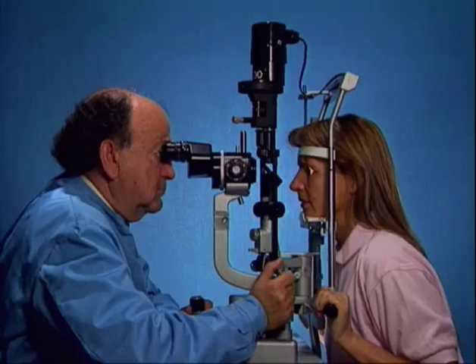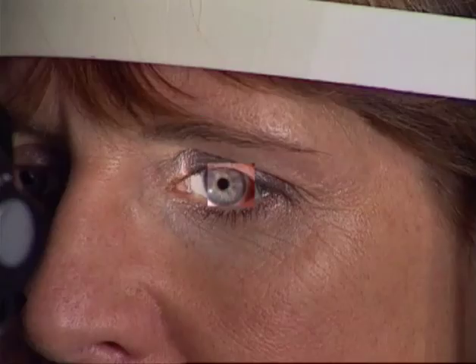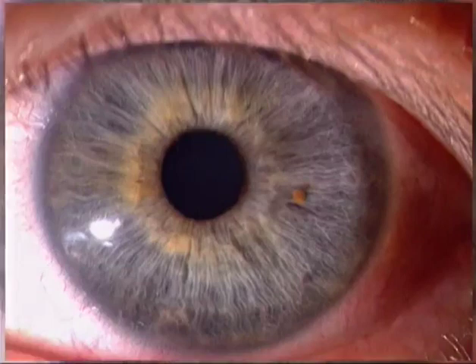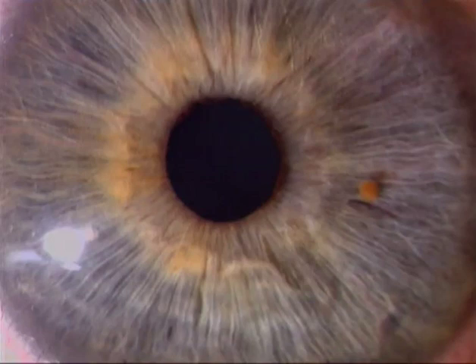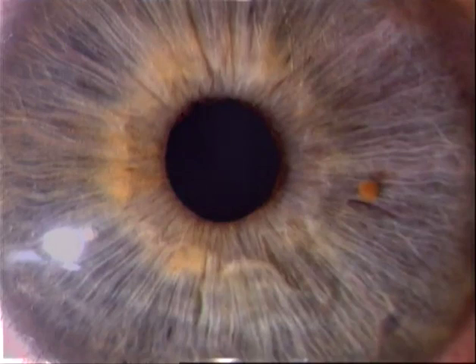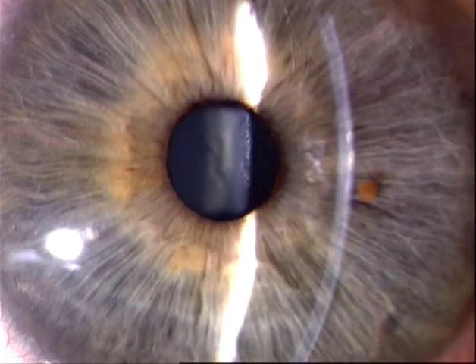Slit lamp biomicroscopy is a technique for examining the eye at various magnifications, as for example the fine structure of the iris shown here. But many tissues in the eye are transparent and therefore invisible. They must be made visible before they can be examined.